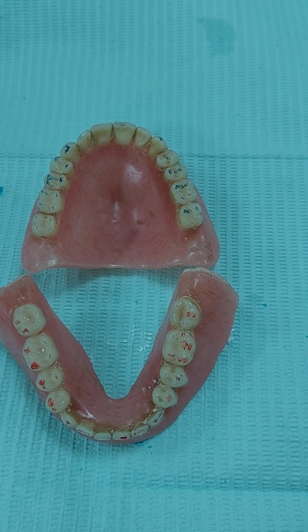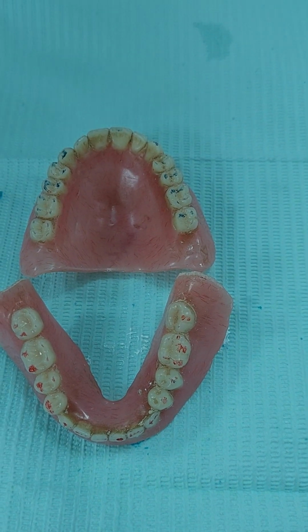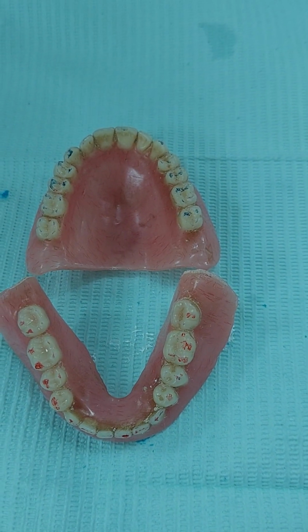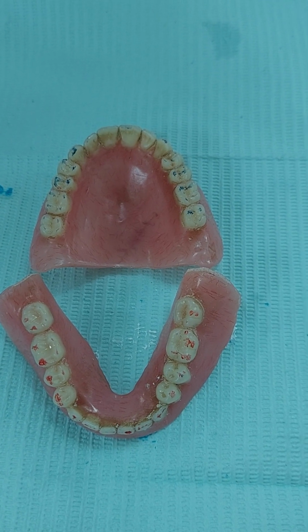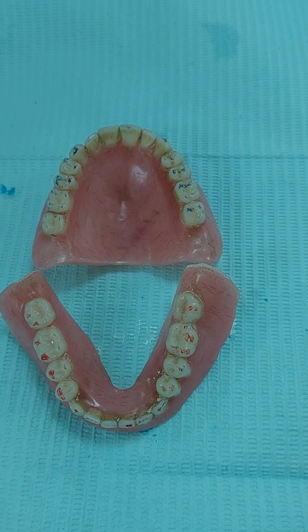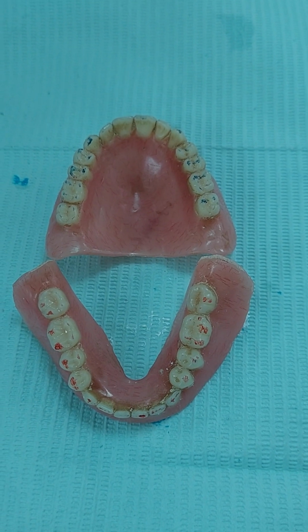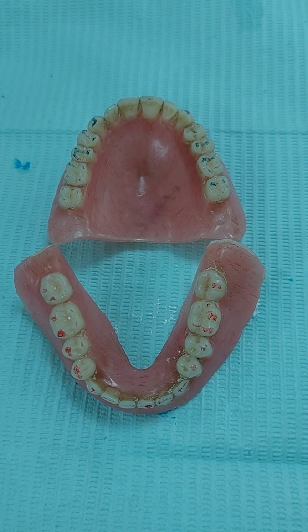Are the lingual cusps taking the bite the same as the functional cusps? No. What does this mean? This means, on excursion, there is uneven or unequal contact. That means there might be an incorrect curve of Wilson. Do you remember that the lower cusps should hug the upper palatal cusps? Yes. So this curve of Wilson might be incorrect, unless we're doing monoplane occlusion or lingualized occlusion.